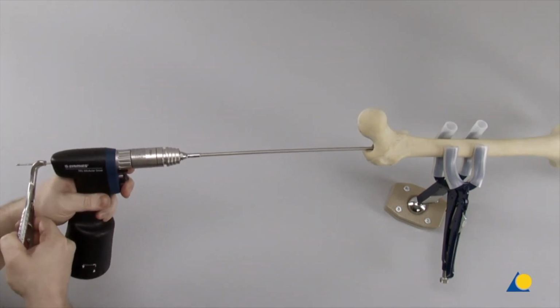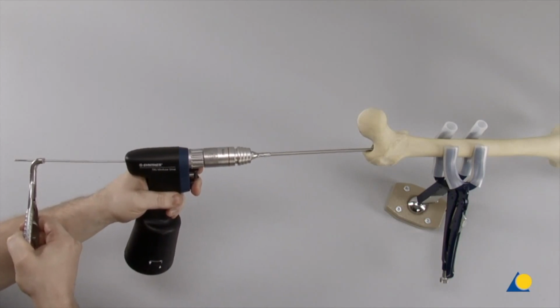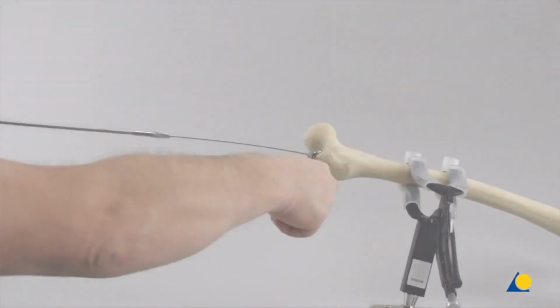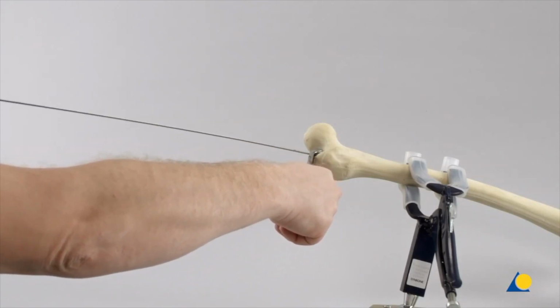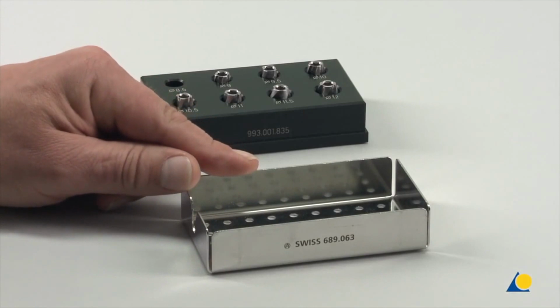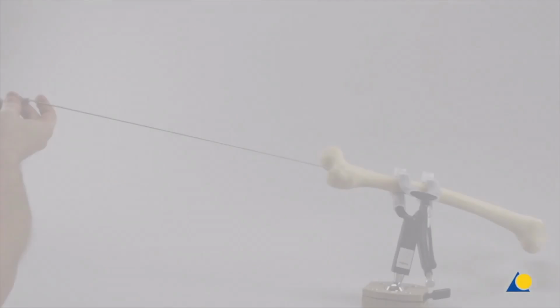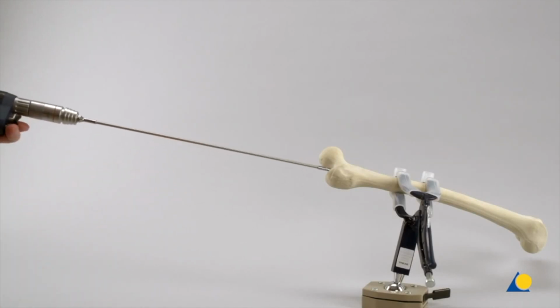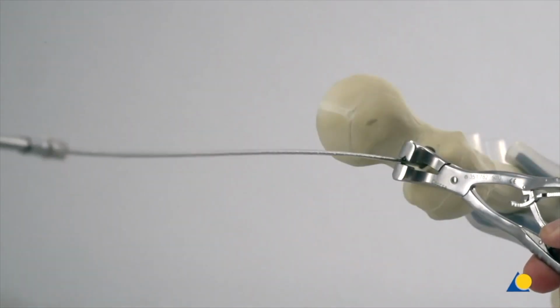The holding forceps is used to control the rotation and to prevent inadvertent extraction of the reaming rod. The fracture reduction must be maintained and confirmed under image intensification. The used reamer head can be detached from the flexible shaft using the slot on the side of the collection tray. The reaming procedure is repeated until the desired diameter is reached. The reaming assembly is removed, leaving the reaming rod in place.